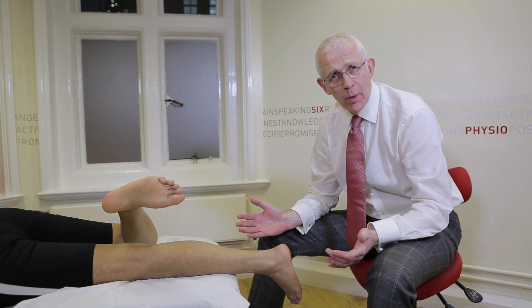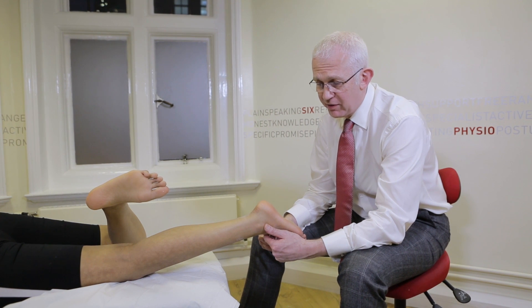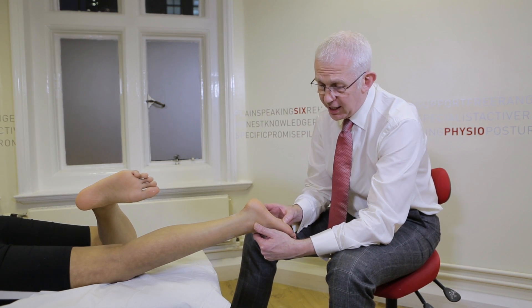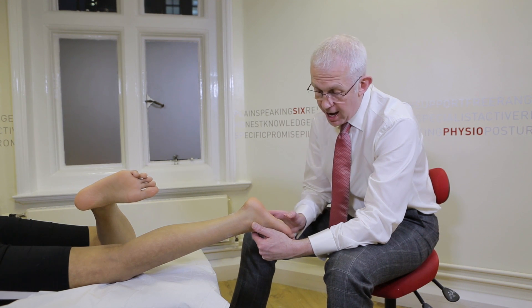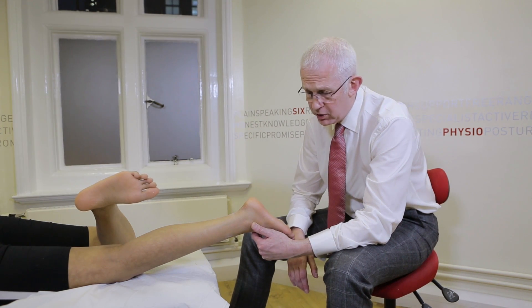Other considerations when we're preparing is whether or not we want to make any skin markings so they come out on the cast for the benefit of the lab. That might be for something such as where the key pain is for plantar heel pain, if someone's got a particularly tight fascia so we want to mark the fascia for a fascia groove, or if they have pain beneath the border of the foot and we want a redistributive pad to locate where the pain was.